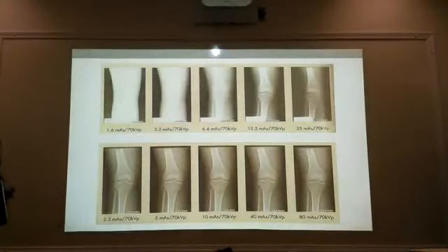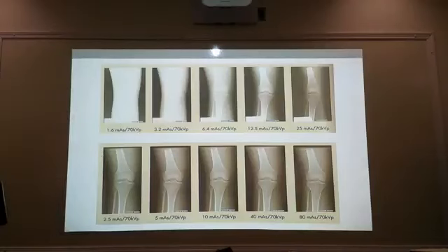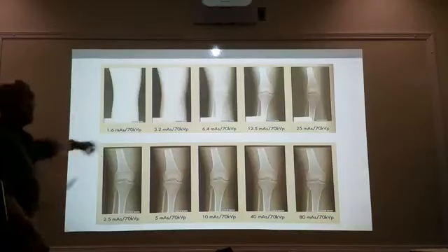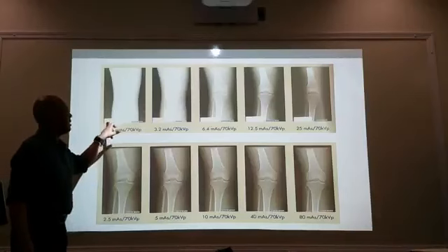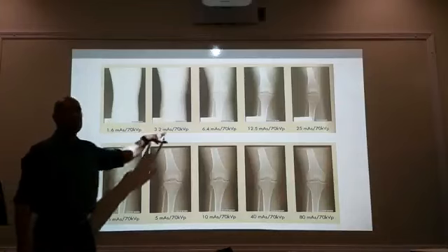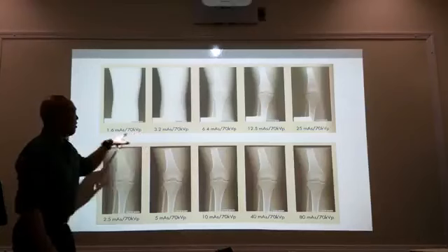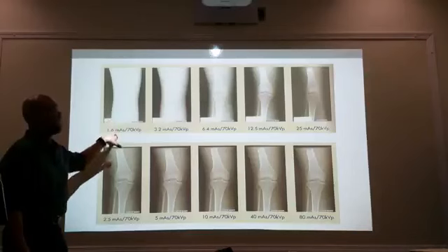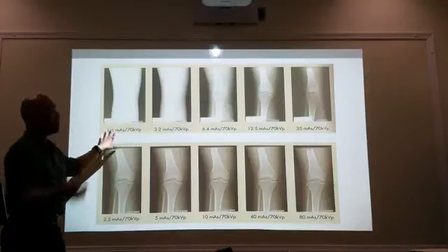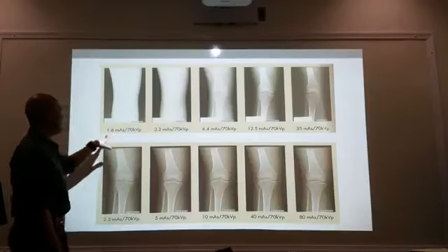This is what's happening here. We've got two studies of the knee. Up here is your radiographic study utilizing film. kV remains constant, so we're using 70 kV in each of these images. With our first one, we use 1.6 mAs. Too light, right? So we did another exposure. We doubled our exposure to 3.2. So we went from 1.6 to 3.2.